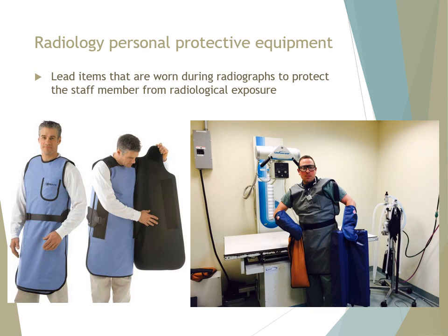And finally, some procedures you sometimes do under radiology assistance. For example, biopsies, sometimes CT scan guided. So you're doing a CT scan at the same time you're getting samples. So you need to wear protection. These shirts look sort of like gowns. They have lead, so it protects you from the radiation. So those are some, not all, of the equipment that we use when you do orthopedic surgeries.